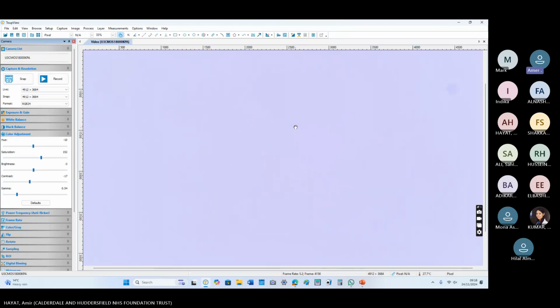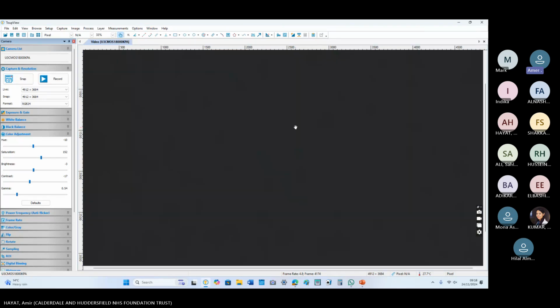Now to compare the previous slide with this slide.